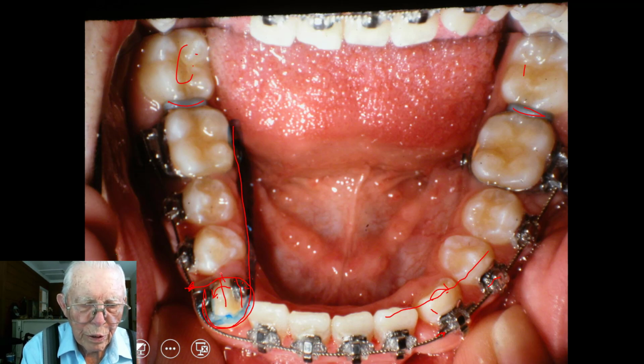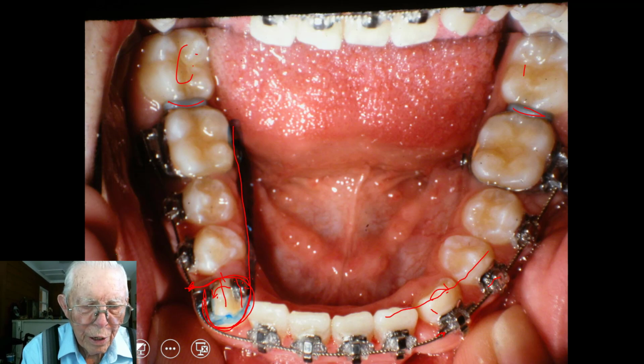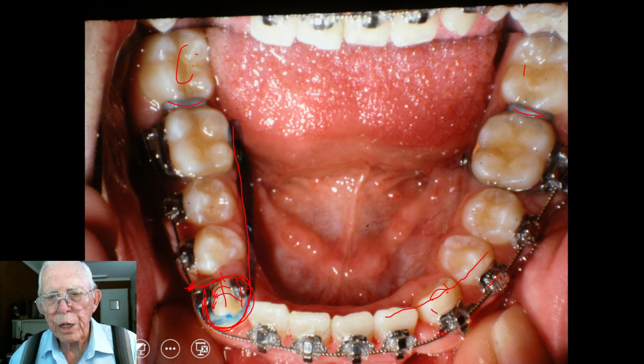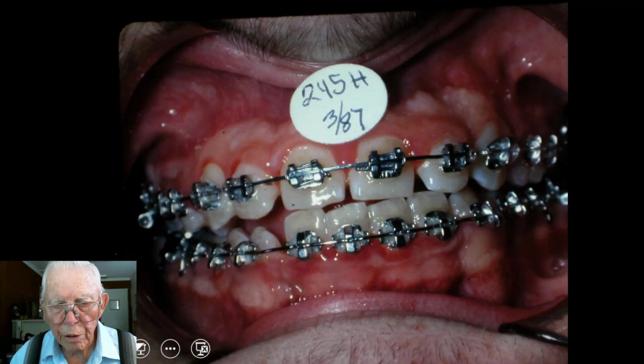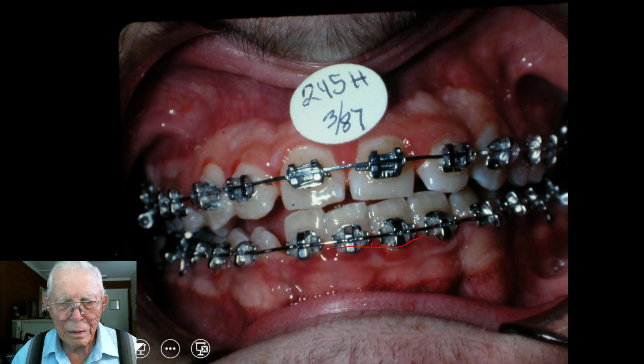But here we're closing a space on the tooth too. But that's rather minor. But you hook this elastic in there, put it around, hook it there, but don't hook it on the wire. It'll spin that tooth. Just so easy. It's the most efficient way to rotate any kind of tooth I've ever seen. So let's go on here. Now we're in pretty good shape here. We've got the arches leveled out, and I don't have him brush it as good as I would like, but you just do the best you can with that.